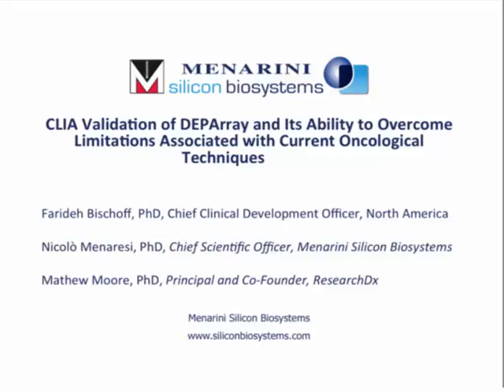Well, let's say improvement, we don't have really comparative data. I would rather say that the condition may actually differ a bit. It's just a matter of finding the right conditions for antigen retrieval. Of course, when we deparaffinize, we also disaggregate with some gentle enzymatic digestion. So this is why we developed the kit, because we wanted to provide a turnkey solution. But as with all other immunohistochemistry, you need to find the proper conditions to make your antibodies work.